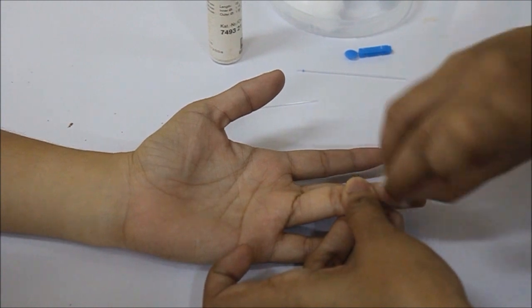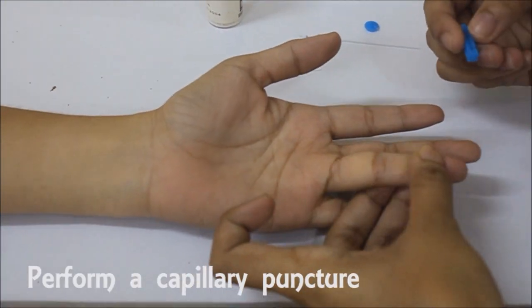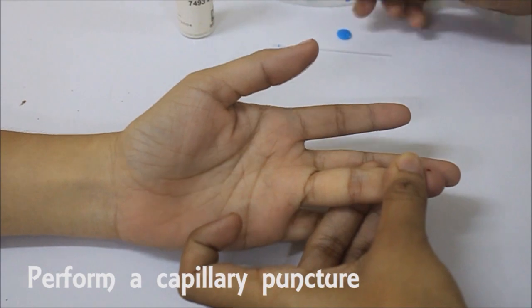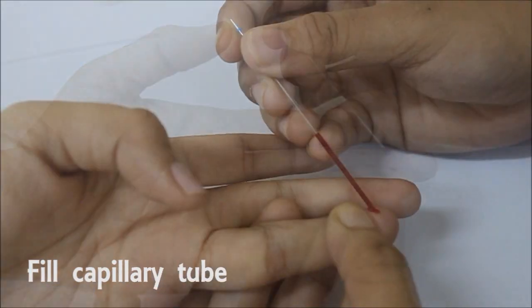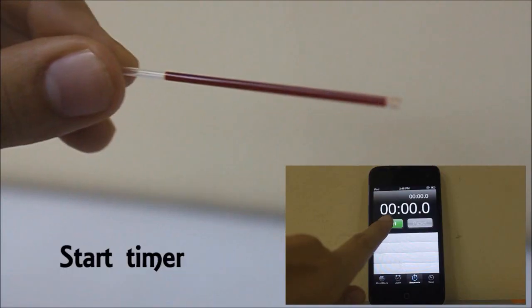To perform the capillary method, first collect blood at the capillary puncture. Fill up a non-heparinized capillary tube and start the timer.